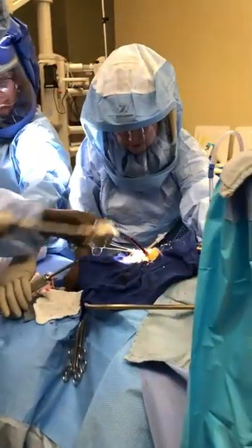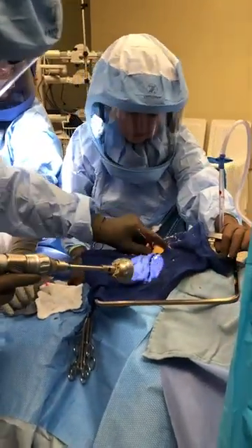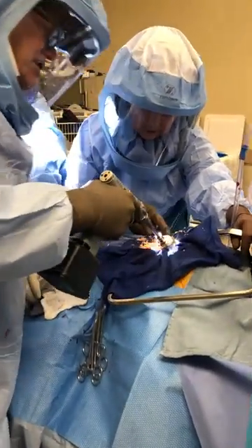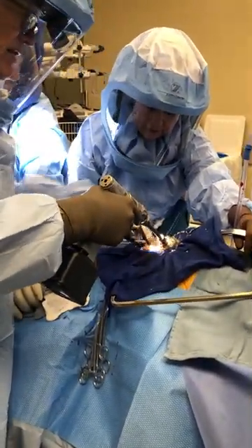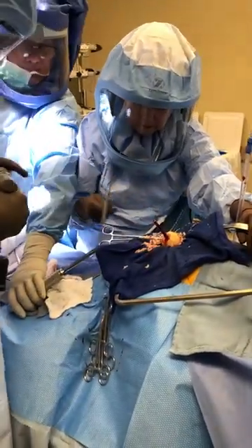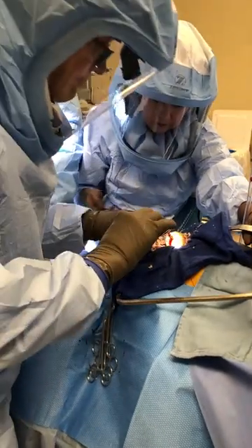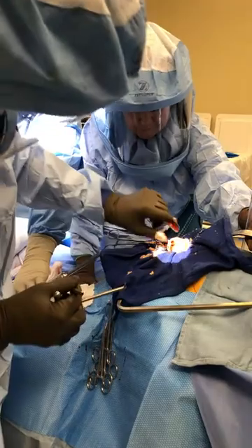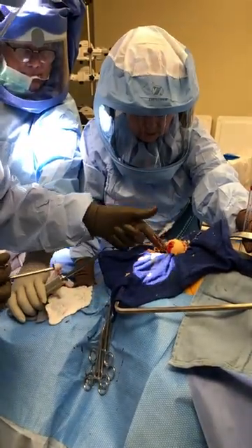I can see how it's spinning now on the top of this post. It's got a good resection. I like my position at the head and neck junction. Inferiorly, you can check it however you want. I've taken my six millimeters. So now I'm going to extract the post again — you can see there's a nubbin of six millimeters, which is another way to double check.